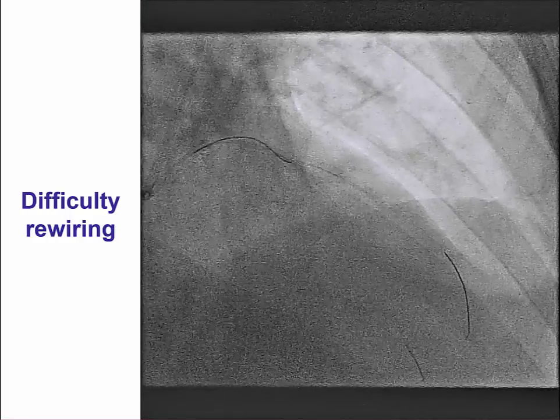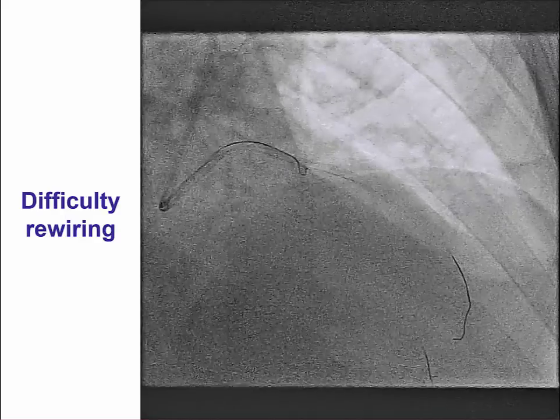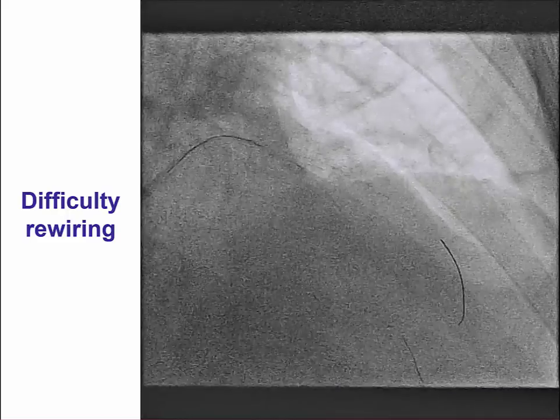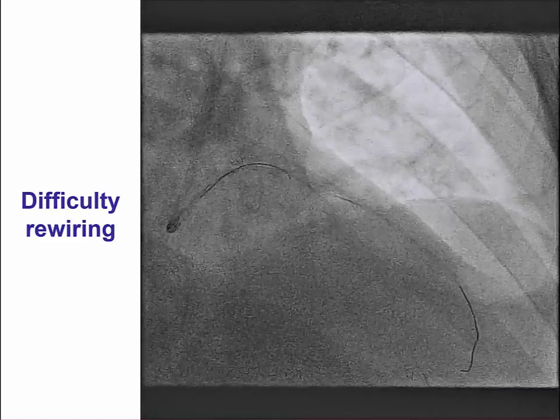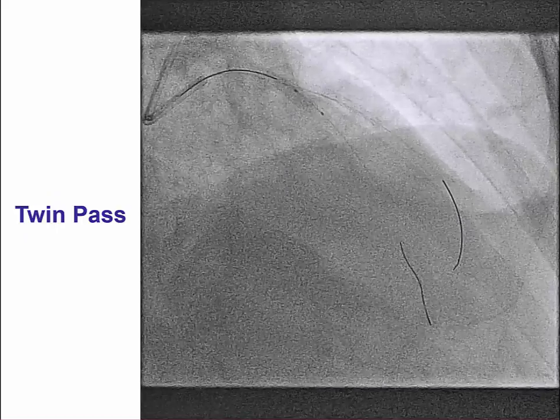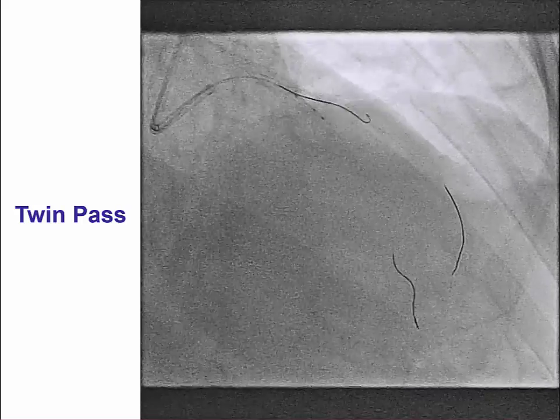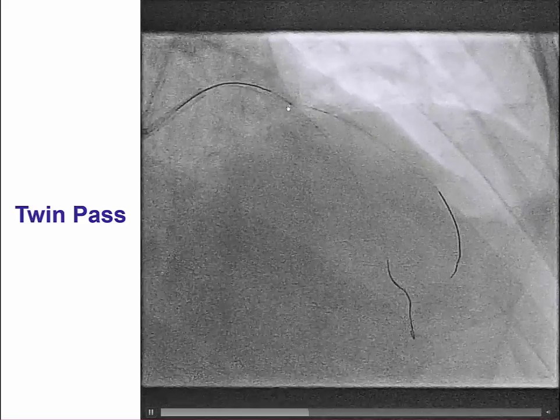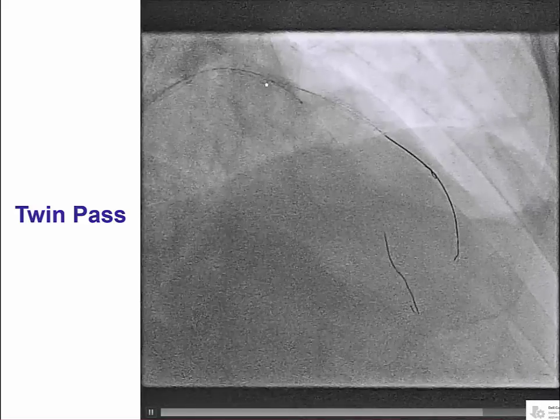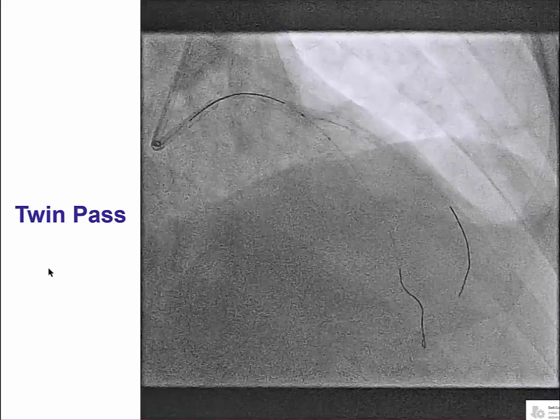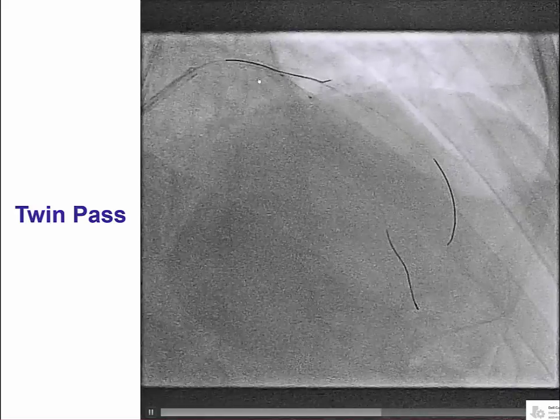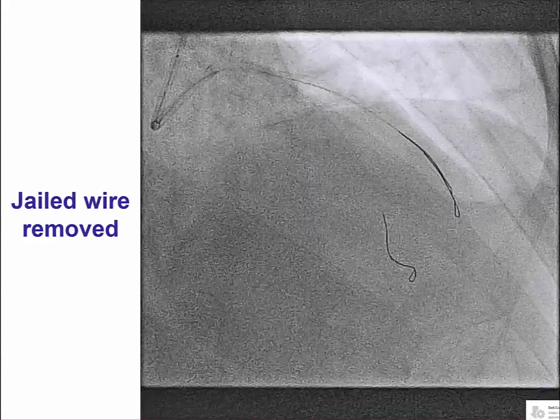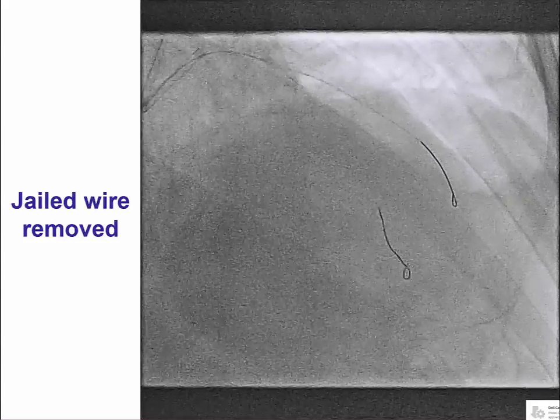What can sometimes be challenging after deployment of the main vessel stent is rewiring of the side branch. We actually did have some difficulty advancing a wire into the diagonal after LAD stent deployment. To overcome this, we used a TwinPass dual-lumen microcatheter. These microcatheters have an exit port proximal to the proximal marker, and by doing that it was easy to advance a workhorse guide wire into the diagonal branch. We then removed the jailed guide wire, which came back easily.